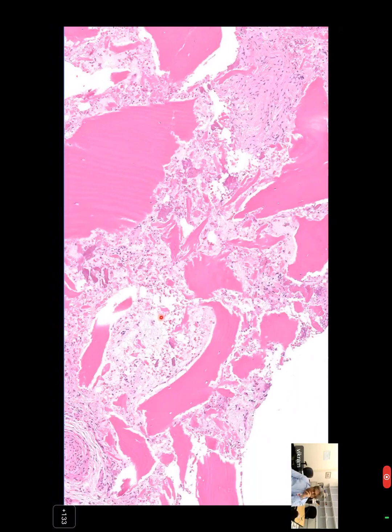Sir, in this image, in the rightmost lower area, is this a nerve bundle that we see? I think it's a vessel. It almost looks the size of a nutrient artery, which is about where the nutrient artery enters, or one of the branches of the nutrient artery. It's a vessel, actually. I think it's tangentially cut and the lumen looks almost obliterated, doesn't it? But it's not a nerve. Intracapsular vessels are very prominent in kids. This is the femoral neck area, and the vessels are on the surface below the capsule. So I think this could be one of those big vessels which supplies the femoral head.